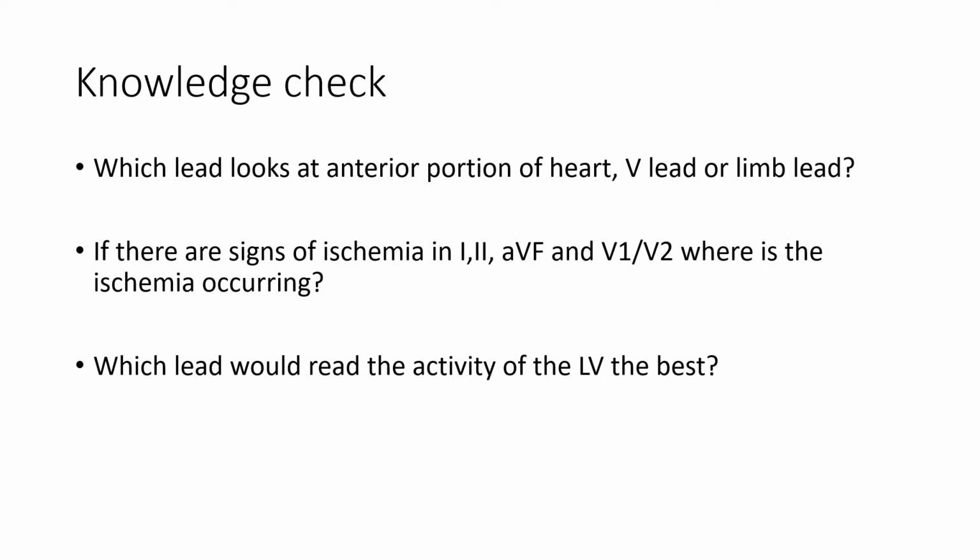Which lead would read the activity of the left ventricle the best? And that would likely be leads V5 or V6, since they are located more near the apex of the left ventricle.